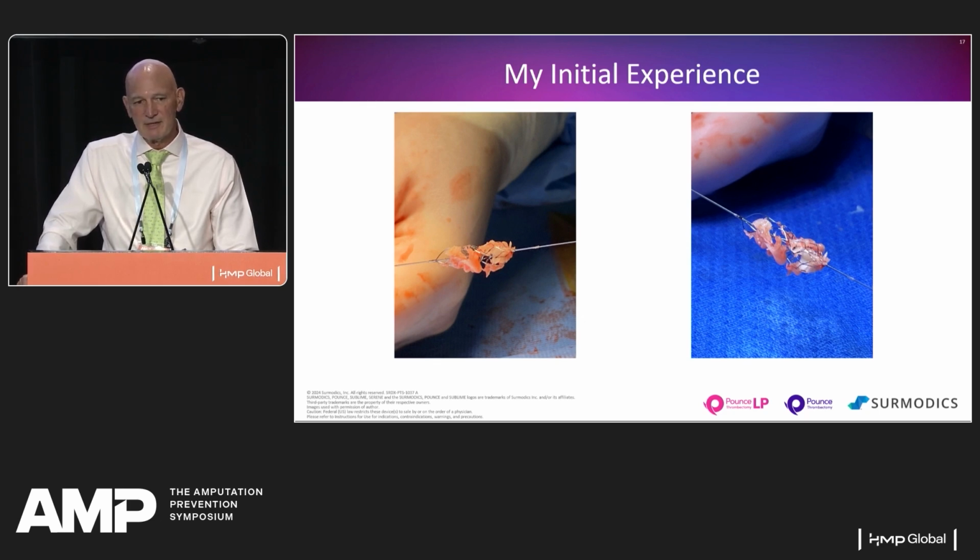And it convinced me that there were very few devices that would be able to remove this type of material from an artery. And particularly when I think about emboli that come from the heart, they're very difficult to retrieve with anything other than a catheter that has something to drag the device or the debris back into a sheath, or in surgical situations to bring it out through the arteriotomy that we've created.